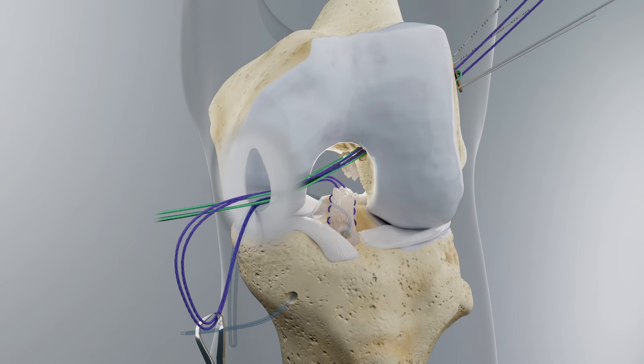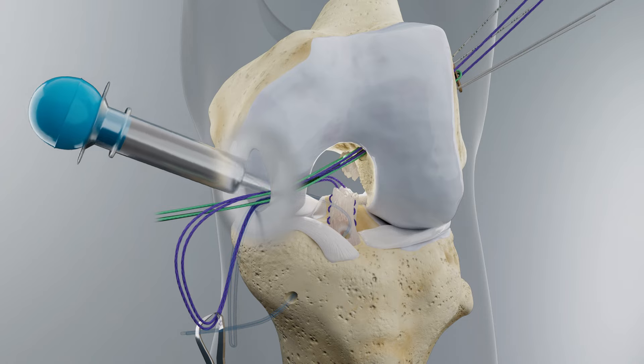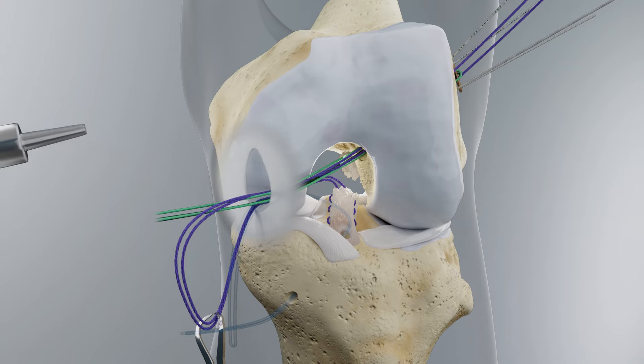Perform a 2-inch arthrotomy at the medial border of the patellar tendon. Irrigate the joint with 500 ml of antibiotic irrigation solution and dry the joint space thoroughly. After this point in the procedure, do not irrigate the joint again. Additionally, a new dry pair of gloves should be used to handle the bare implant.